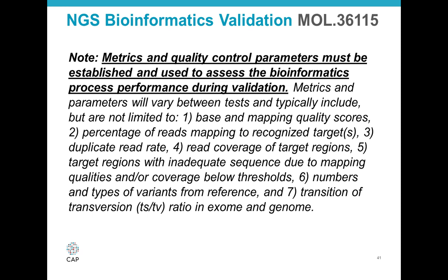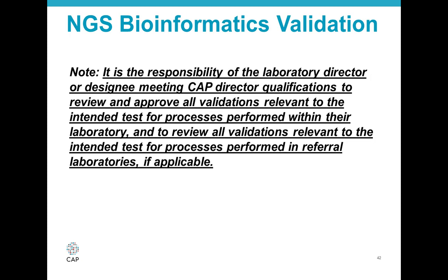As with the wet bench process, metrics and quality control parameters must also be established to assess the bioinformatics process performance during the validation. And again, it's the primary responsibility of the laboratory director to review and approve all of these bioinformatics process validations and also bioinformatics processes that might be performed in possible referral laboratories.